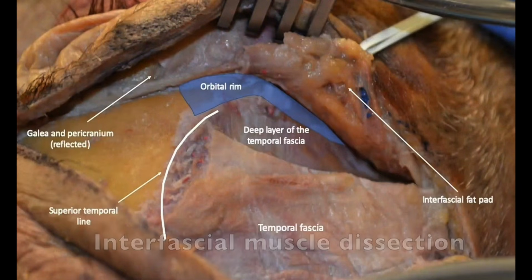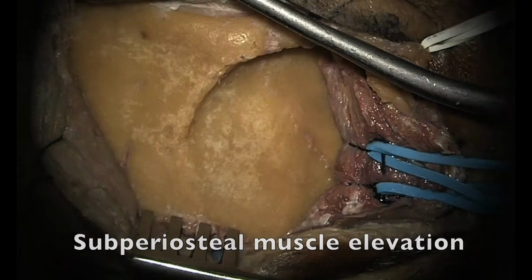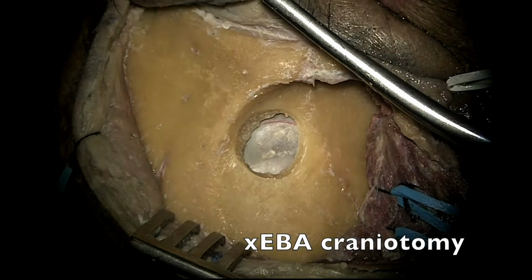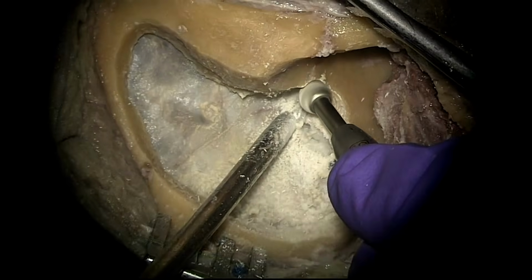The temporalis muscle is then disinserted from the superior temporal line and is dissected downward, allowing for the exposure of the pterion. This step is critical as the pterion corresponds to the most anterior point of the sylvian fissure, what is called the anterior sylvian point.